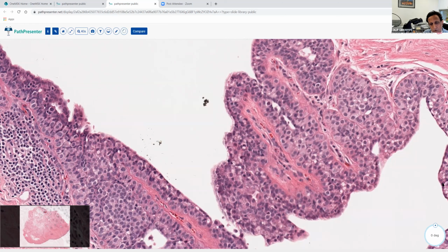It will show you the cells that are ductal, which morphologically, again, you will have a sense of, and that is why, to begin with, you will be asking this question, whether there is involvement by both DCIS and LCIS. So the stain will only help you confirm what you already had suspected morphologically. So there is no difficulty in terms of the resolution power with E-cadherin stain. The problem happens only in how we interpret the staining result.